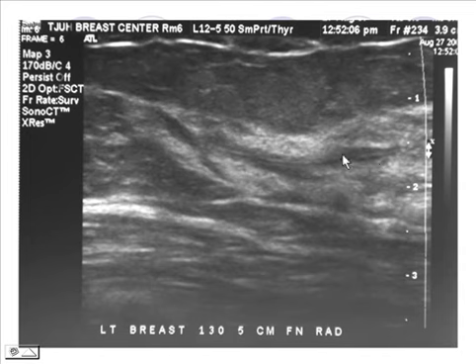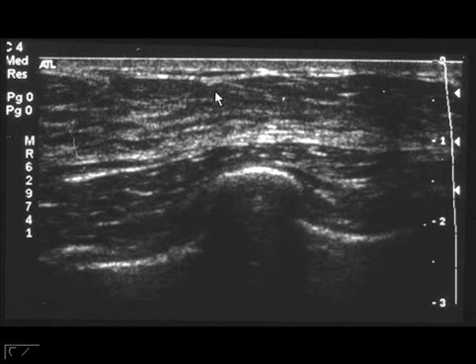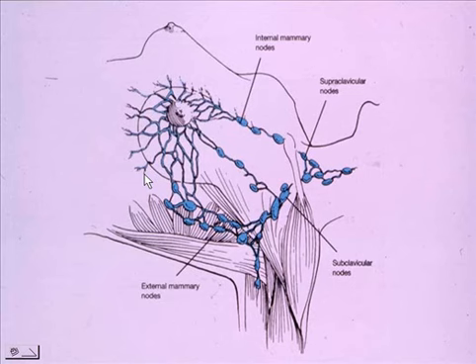We can actually see this bright white line, which is the lining of the duct. It almost looks now like we're looking at an endometrial lining. Of course, you don't see this all the time, but sometimes you can, and this is just a picture of a perfectly normal duct. And here's fluid in a duct. That's normal to see sometimes with ductal ectasia, but what you're looking for when you see particularly prominent ducts are masses or filling defects or areas that look like nodules within the duct wall. And here's a rib, which you can see when you're scanning all the way through the full thickness.